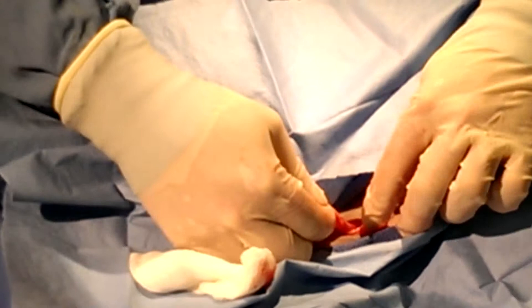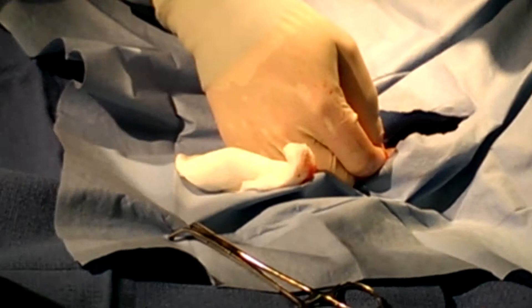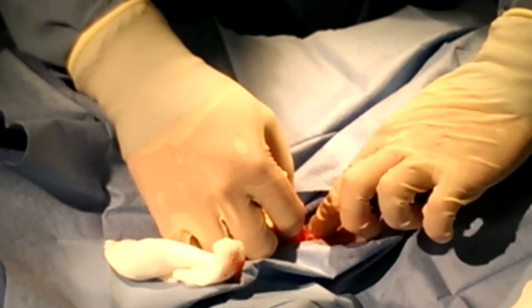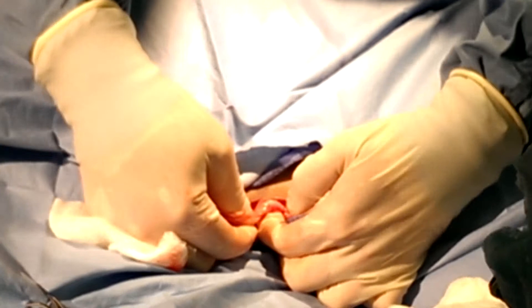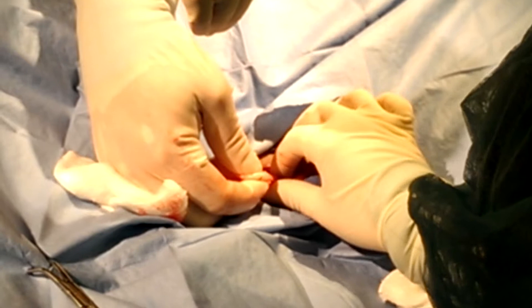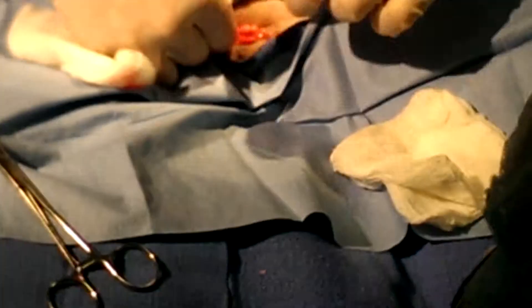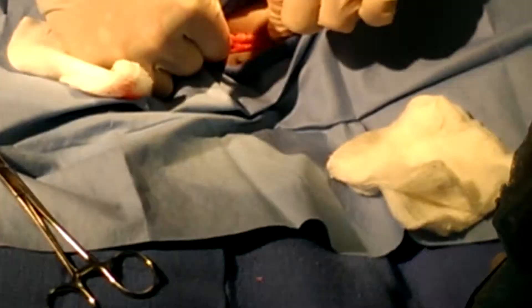Most people who see a spay or neuter for the first time are usually stunned at the lack of blood. If you do it right, you could have maybe one gauze by the time you're done. That is the ovary right there — feel it? It's going to feel like a big lima bean with tissue around it. And this is the suspensory ligament, coming off the cranial side right here — this is what's holding it tight to the back wall. This needs to be broken.